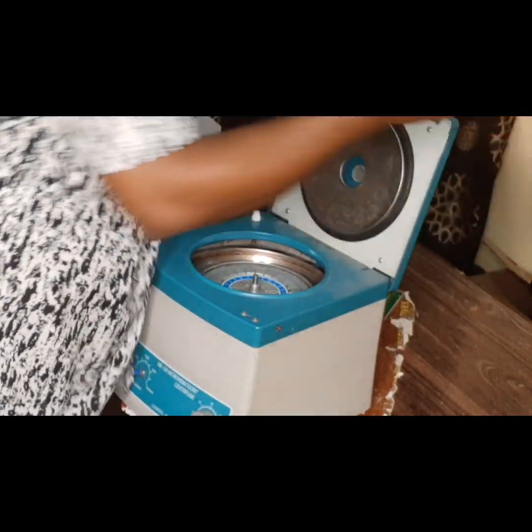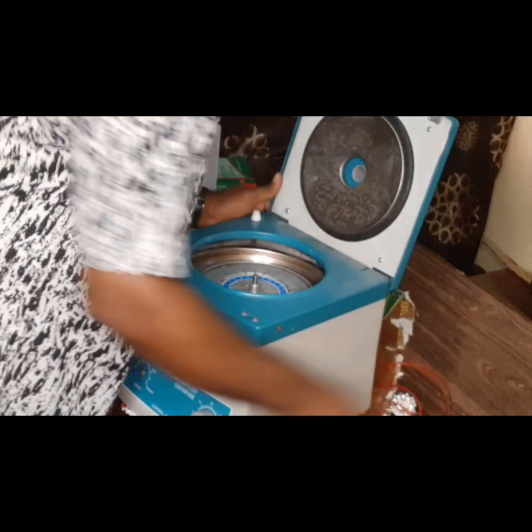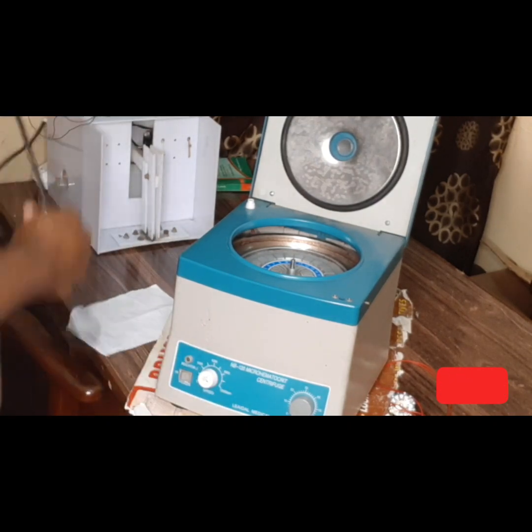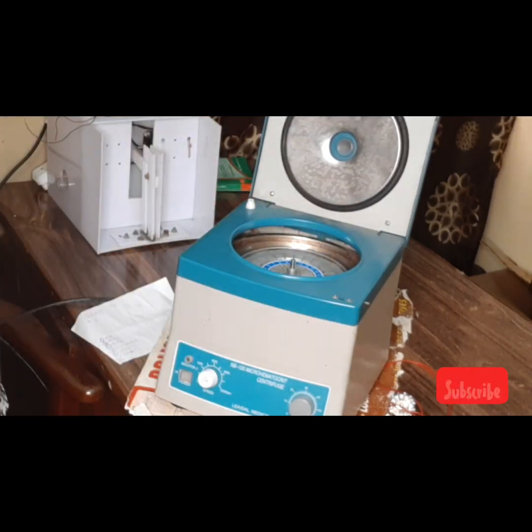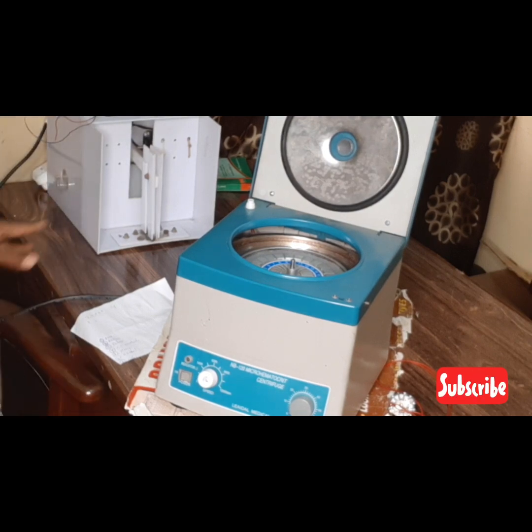So the next thing is to power it. You remember that we changed this, we removed this entirely. So we've been able to introduce another one here. Okay, so let me fit in the power cord for testing. Okay, I've been able to do that. So it's powered right now. So let's do the testing.